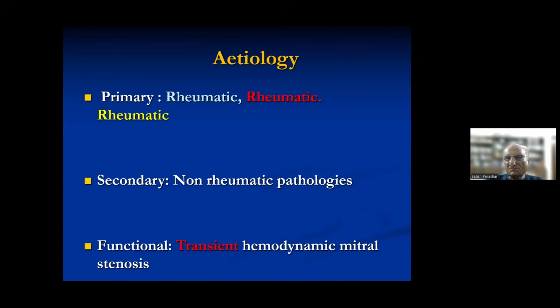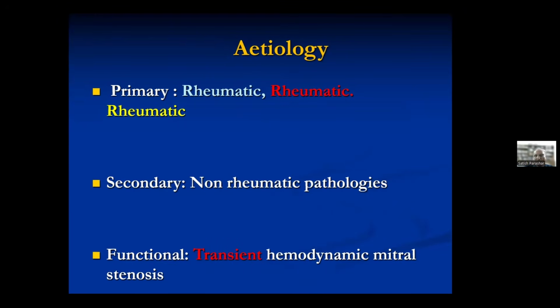When you come for the course, we'll show you some non-rheumatic pathologies we had, including a radiation-induced valvulitis. But the main thing in rheumatic is commissural fusion, thickening at that level, and involvement of the tips of the mitral leaflets. That is how we differentiate. In your life, the majority will be rheumatic. Once you are master of this subject, we can show you more, but I did not want to overload you at this stage. Thank you very much, sir.